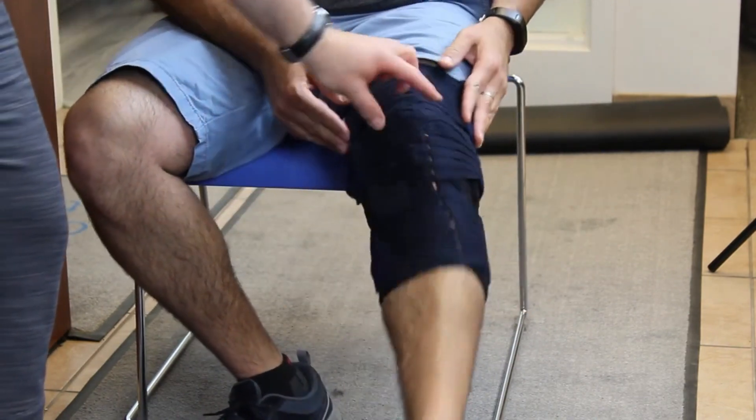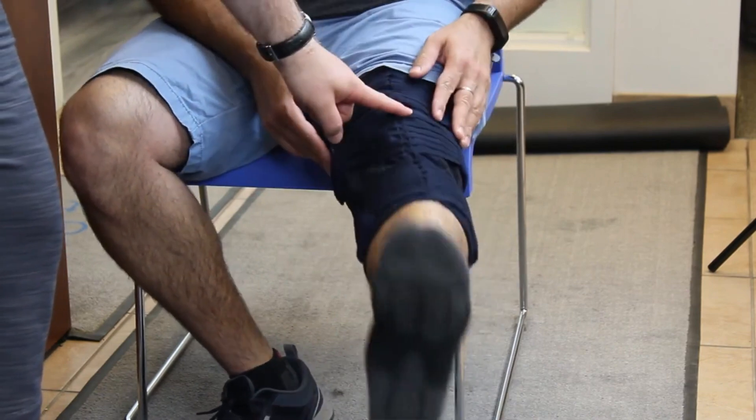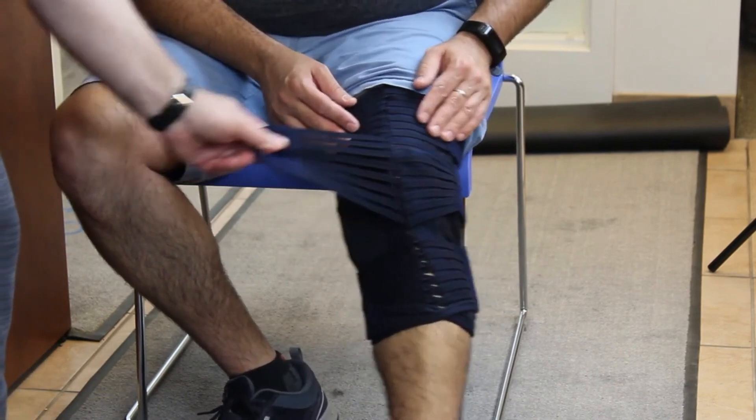You can decide how tight it will be — you can tighten it a bit more if you want more support, and now it's really holding the knee.